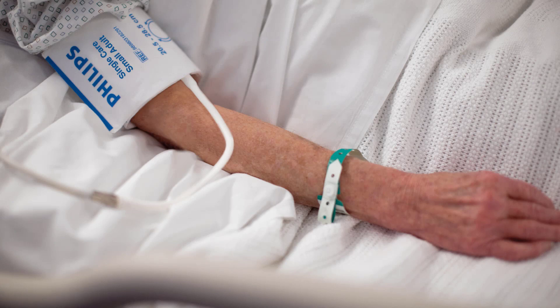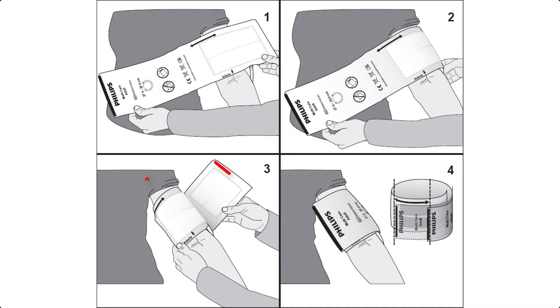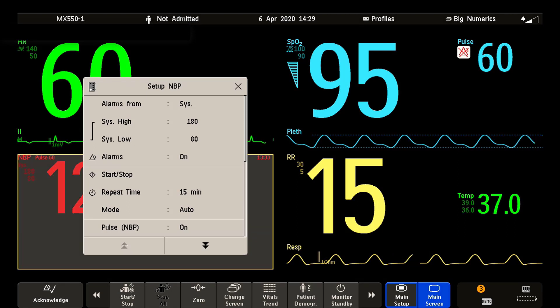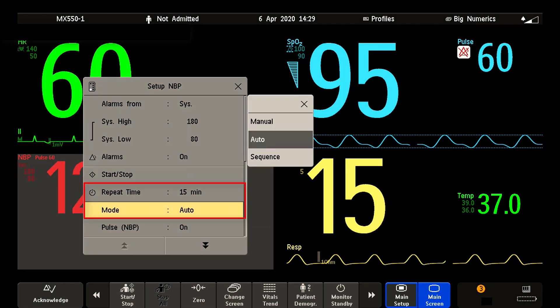To measure non-invasive blood pressure, use a proper cuff size and limb position before measuring. When you wrap the cuff snugly around the patient's limb, ensure that the index edge falls within the range indicated by the range arrow. Try to apply the cuff to a limb at the same level as the heart. Set the NBP mode to Auto to obtain an automated measurement with a regular time interval.